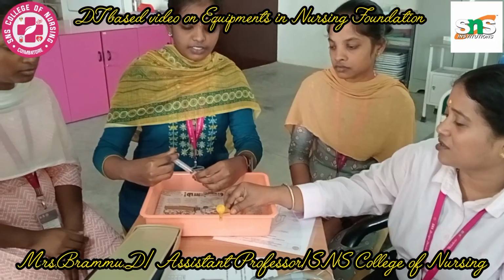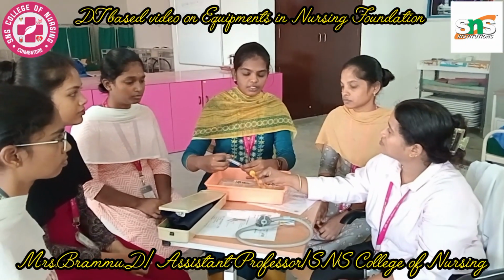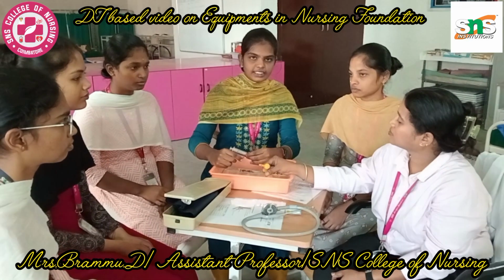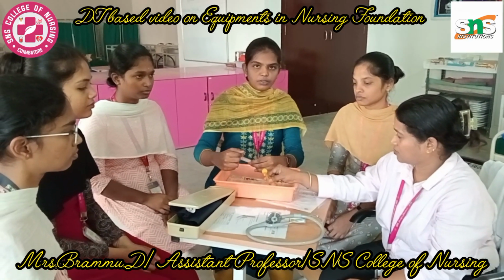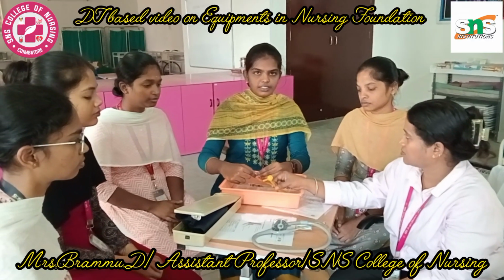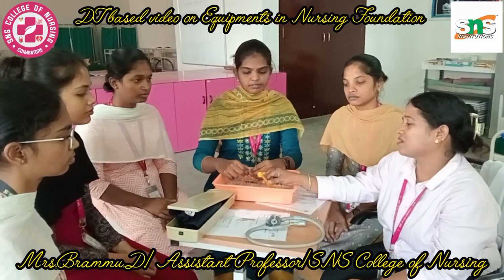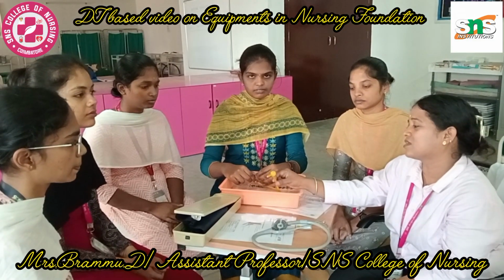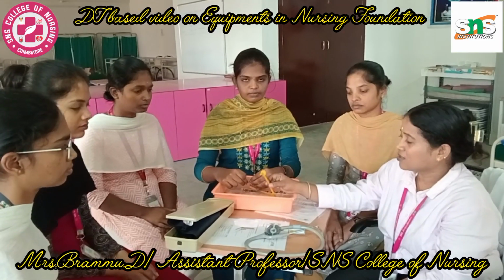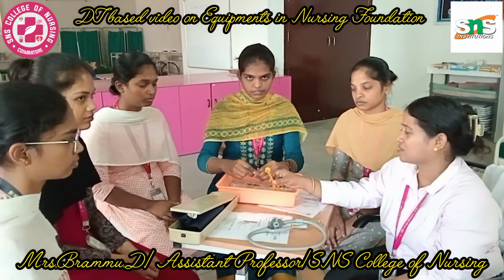Please describe why it is helping, Soumya. To make sure the catheter is stable at the site, not to slide down from the site area. So it is actually avoiding the slipping from that particular site, and it is helping the catheter to stay in situ. In simple terms you can say it is preventing the displacement of the catheter.